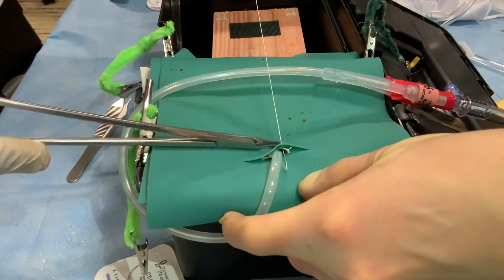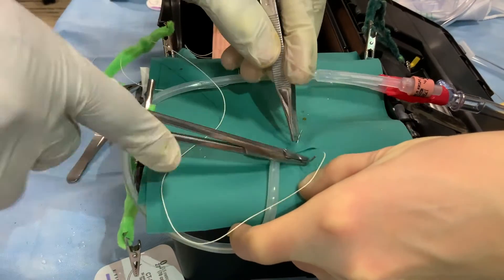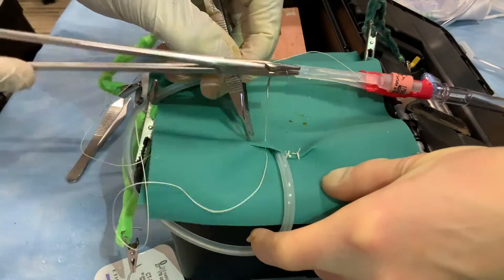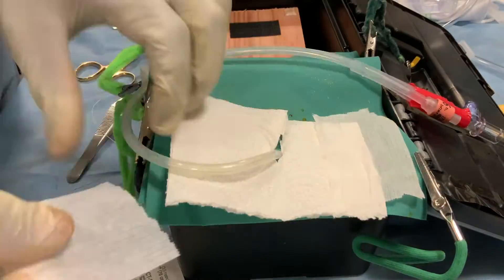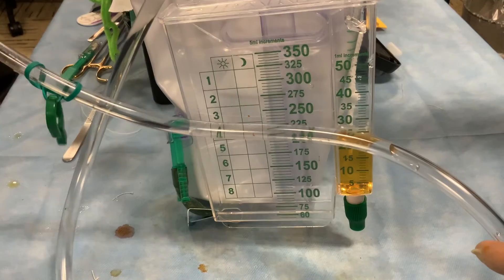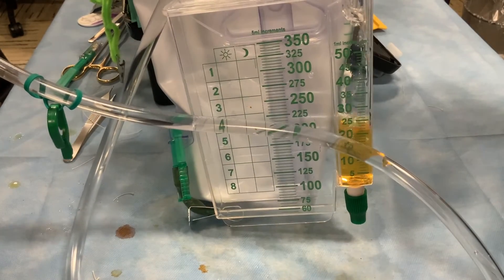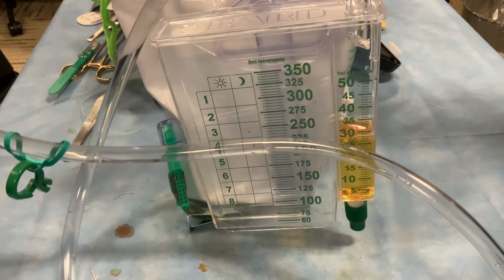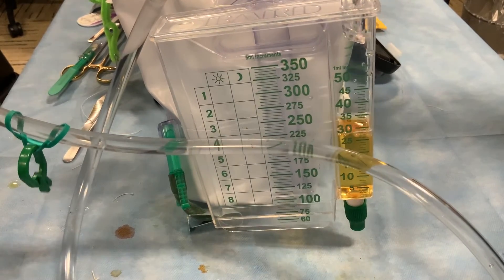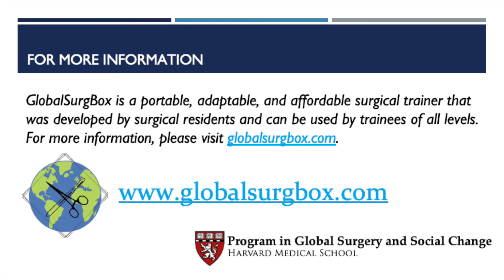The skin can then similarly be closed on either side of the catheter with several simple interrupted sutures. A subcutaneous stitch could alternatively be used for this purpose. The incision can be bandaged. The Foley should now be draining urine from the bladder, here colored yellow with a small amount of iodine. Important intraoperative complications of suprapubic cystostomy include bowel injury and bleeding, and risk can be minimized with careful visualization and operative technique. Postoperatively, there can be infection or loss of the catheter track if the tube is dislodged soon after placement. Catheters should be replaced every 2-6 weeks. This concludes the simulation of the suprapubic cystostomy using the global surgery box.